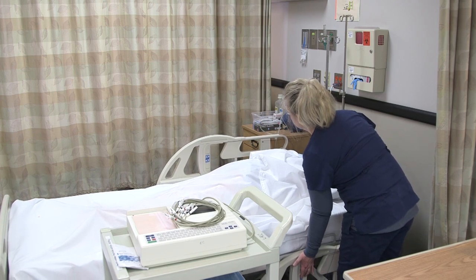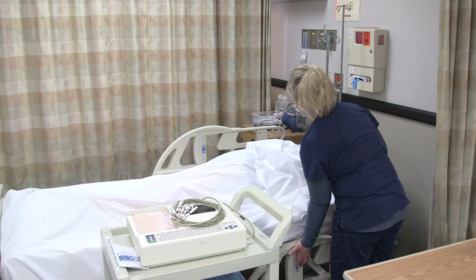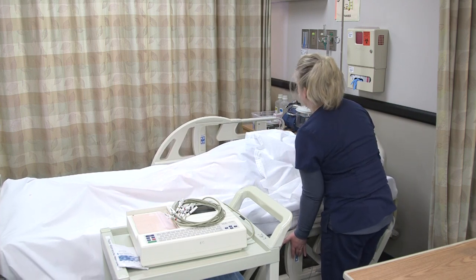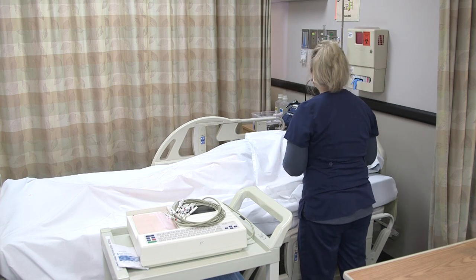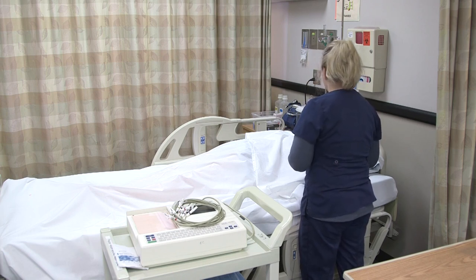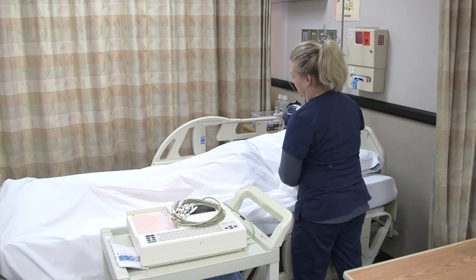I will be putting some sticky patches on your chest wall, also on your lower legs, and then I'll be hooking up some wires. I'm going to be doing what we call an electrocardiogram tracing, which gives us a visual picture of the electrical activity of your heart. Then make sure you answer any questions that your patient may have.